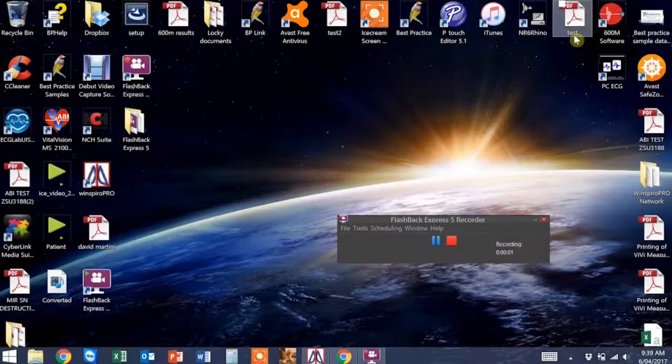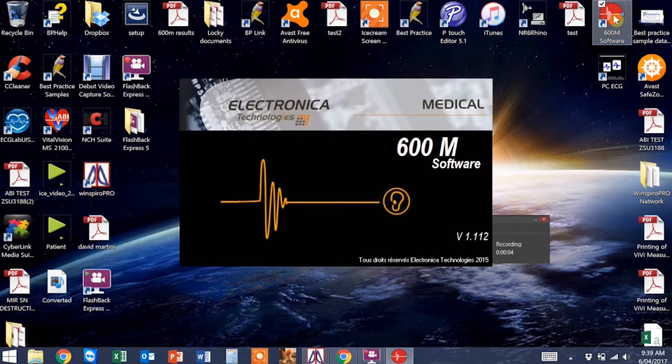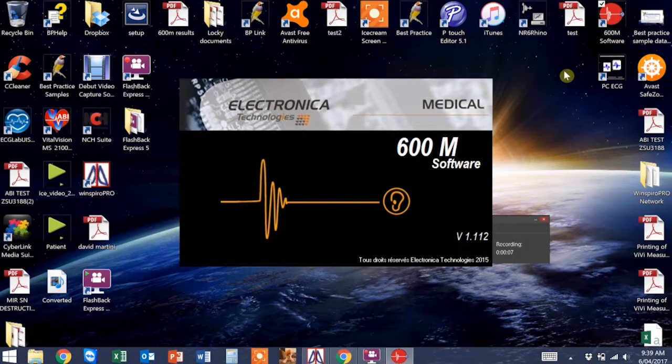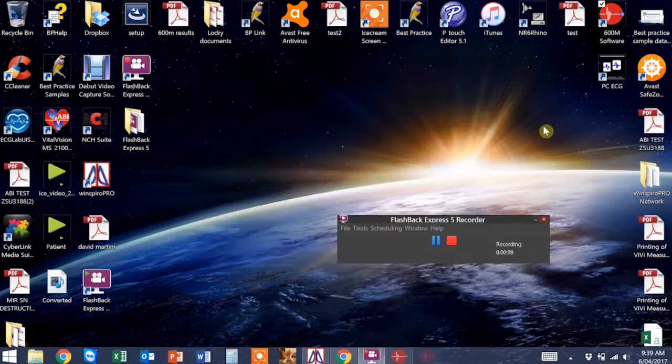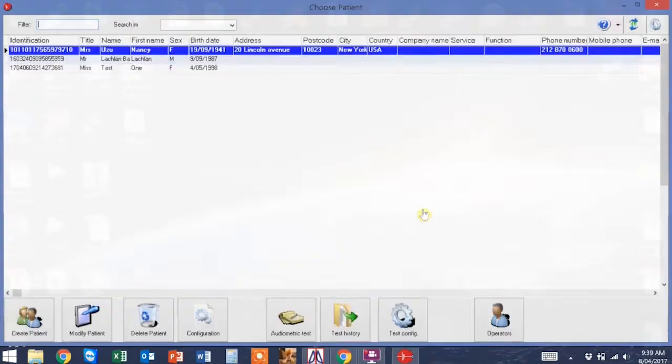To conduct a test, open up the software on your computer. When the next screen comes up, select an operator and click OK.